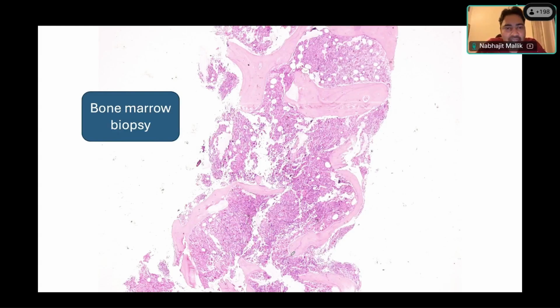We talk about the cellularity. What is the cellularity here? Yeah, cellularity is increased, hypercellular. How much would you say the cellularity would be roughly? 80%. Absolutely, 80 to 90% is something that I would say. You should always give cellularity as a range, because different areas will have different cellularity. But yes, for a 65-year-old lady, you agree that there's a hypercellular bone marrow. We thought so in the aspirate as well, but now we are confirming in the biopsy scanning view that this is definitely a hypercellular bone marrow.